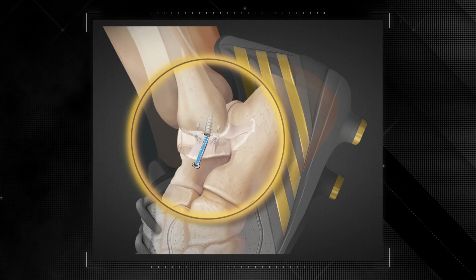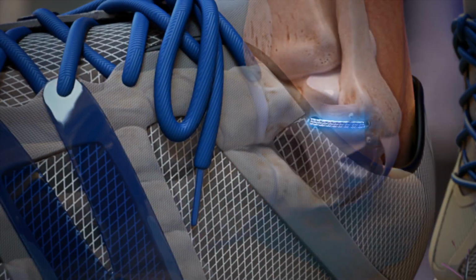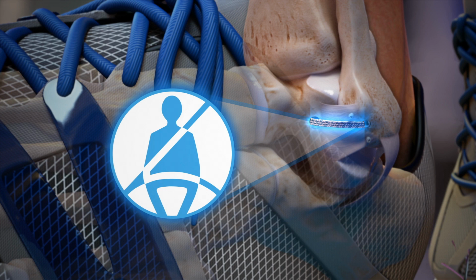You're putting an anchor in the fibula and one in the talus, and you're reconstructing and basically putting a seat belt on the lateral ankle, which would later lead to improved stability for the patient. The Broström repair is very critical to me because you must repair the ATFL along with stabilizing the lateral ankle.